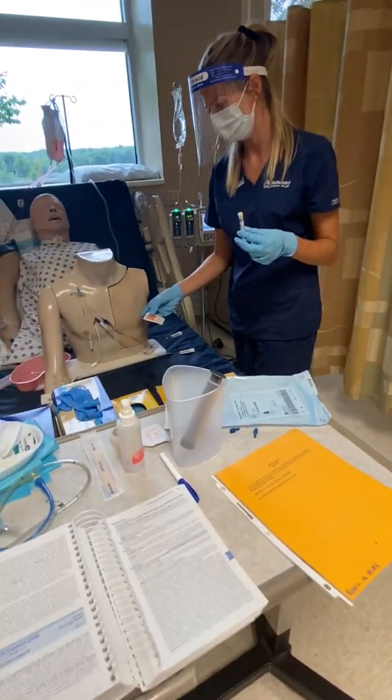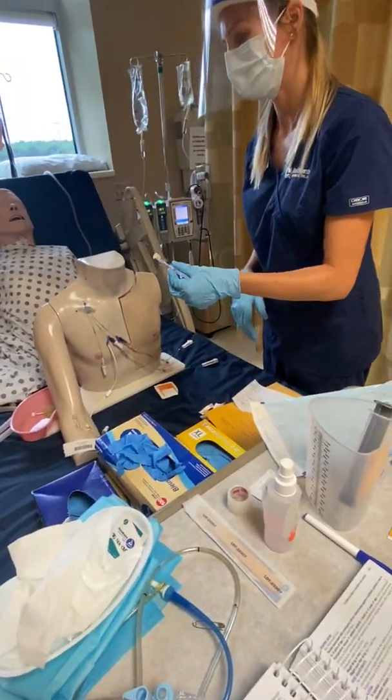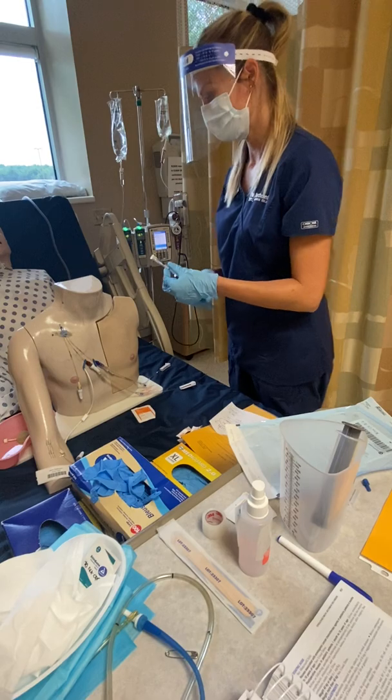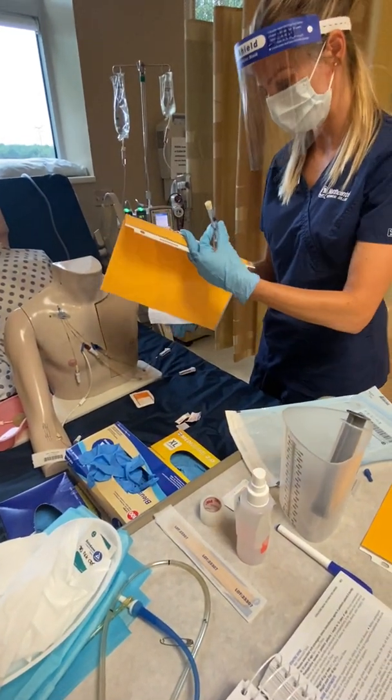And then I'm gonna bring this over and also bring over an alcohol wipe. And then Jane, could you just verify your name and date of birth for me again? And she says Jane Dickinson, 3/24 of 33. Yep. Just double checking that.